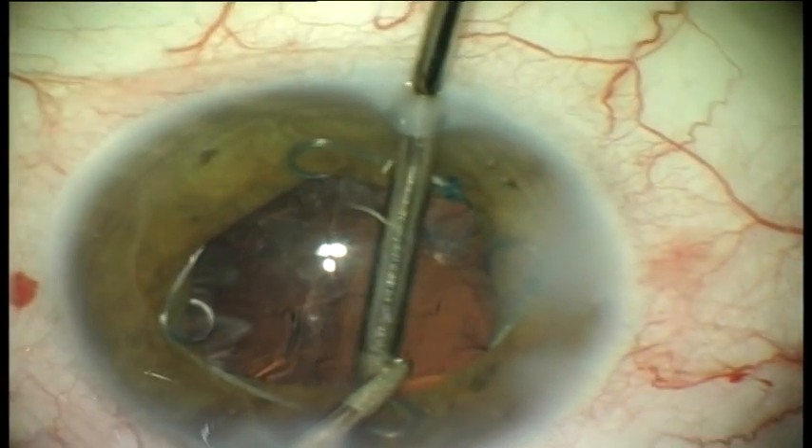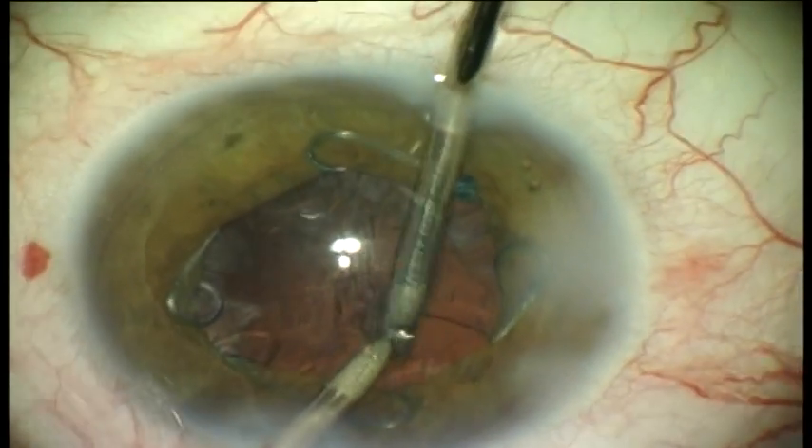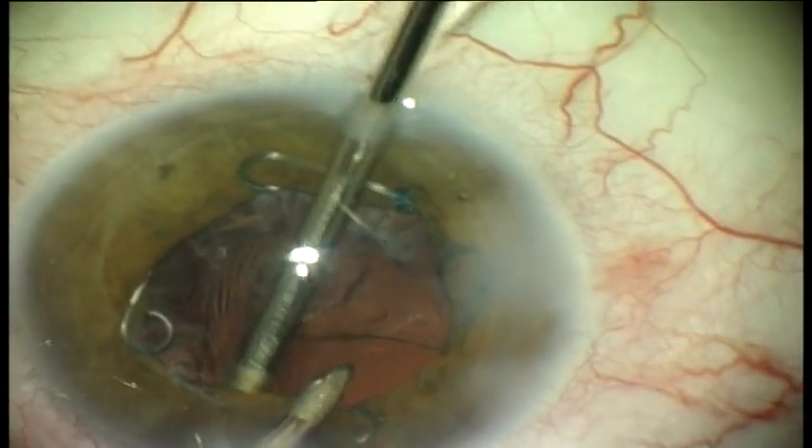During irrigation-aspiration, the position of the ring in the iris plane and the diameter of the pupil provide easy access to the equatorial cortical material.